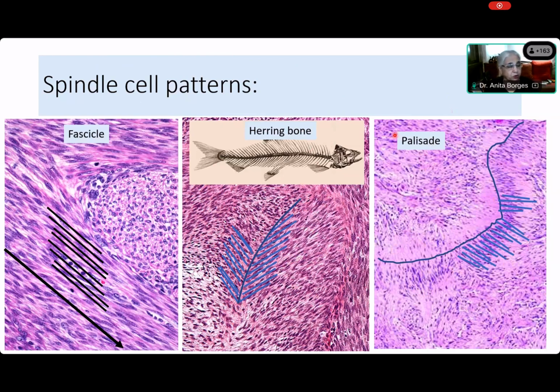Somebody's talking about glioblastoma. That is palisaded necrosis. Yes. So what do you require? What's the minimum requirement that you need for a palisade? It's certainly not a spindle cell. So elongated nuclei. You need the nucleus to be elongated. You just need an elongated cell. So a columnar cell. Yes, a basal cell. A basal cell that has got an elongated body.